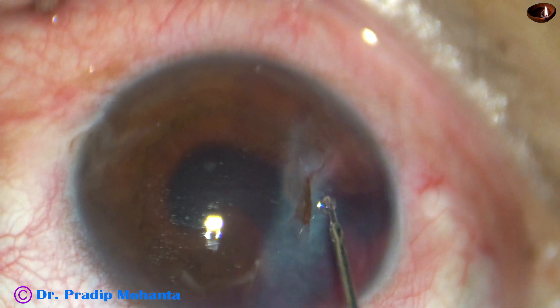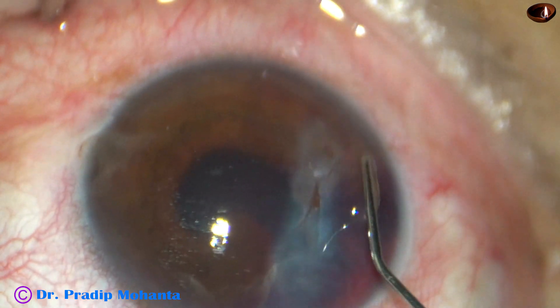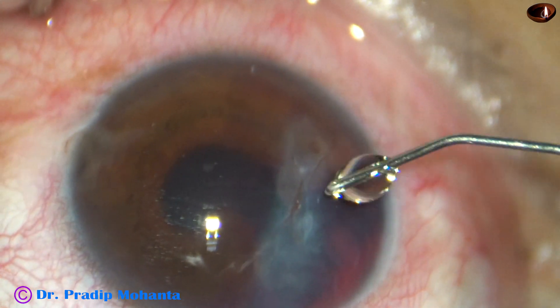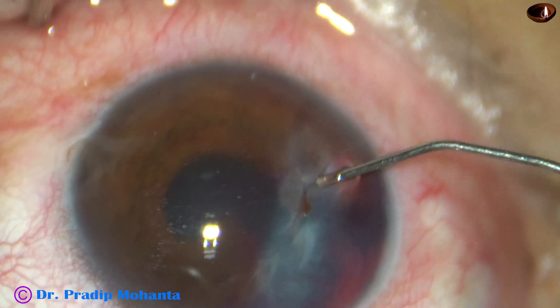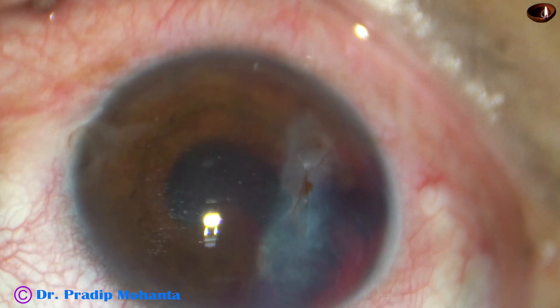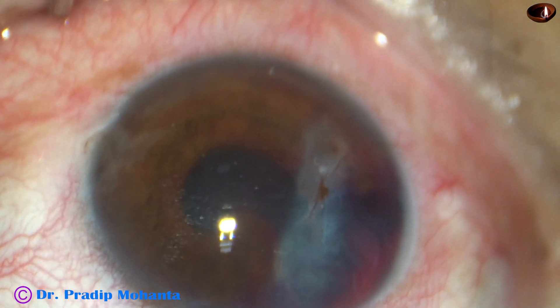Now I have taken this Moxifloxacin — Vigamox from Alcon — and I am infiltrating this Moxifloxacin to the wound, to the lips of this wound.